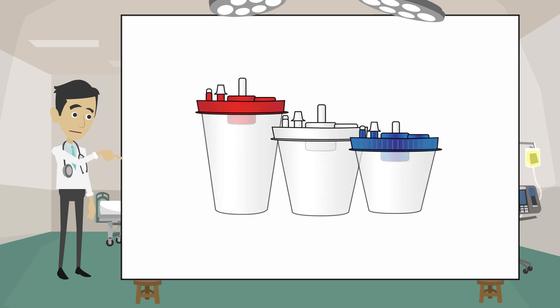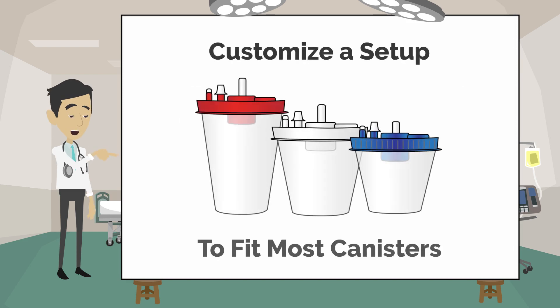Concerned about canisters? Don't be. SCORE can customize the Duet to fit most canisters.